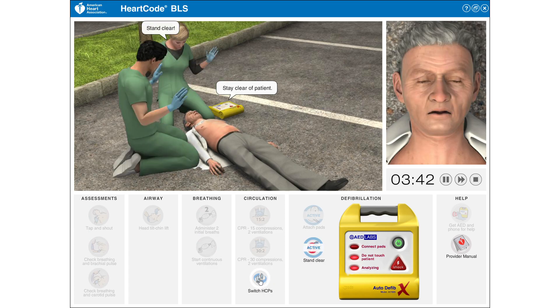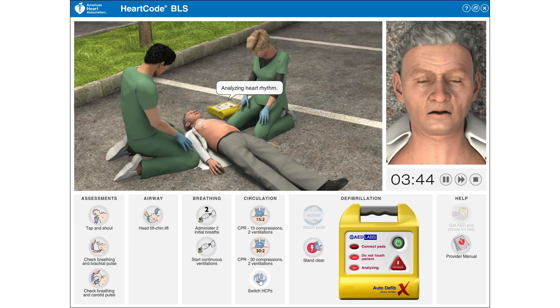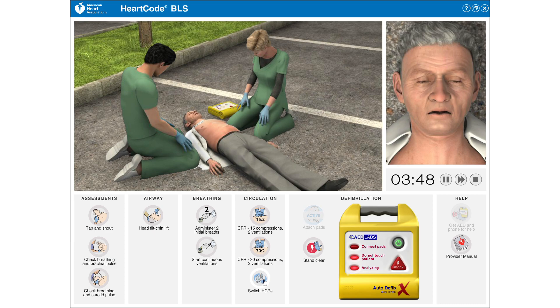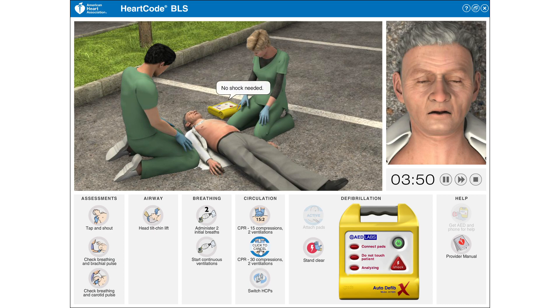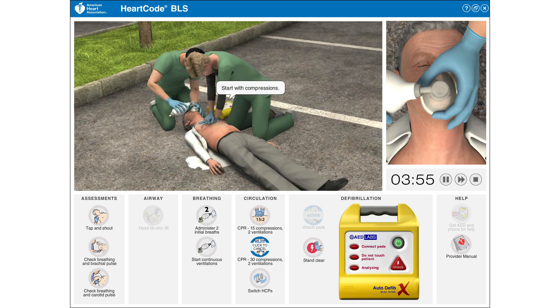Stand clear of patient. Analyzing heart rhythm. No shock needed. Begin CPR. Start with compressions.